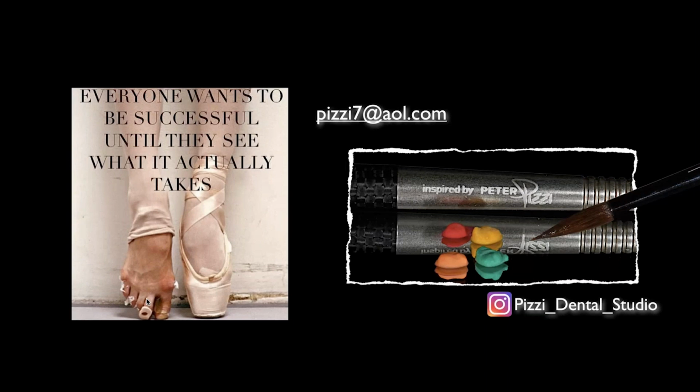All right. And then one last question: at the bench, when you assess your reflection, your line angles, do you just do that visually? Do you use a special light, or do you use a camera and then take a photo and look at it through a photo? Yeah, so that's actually what I do at the end. I'll either draw my line angles on with the flat of the pencil, or I won't, and then I'll just take a quick picture of it, put it on my screen, and look at it and see if I'm getting that light reflection the way I want.